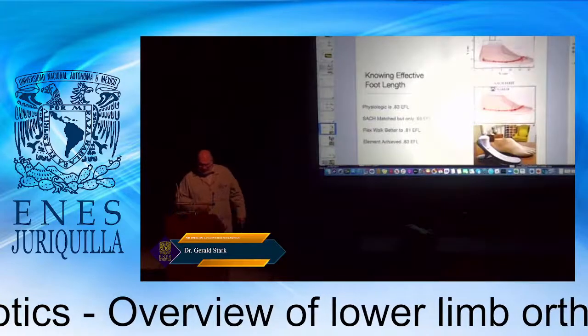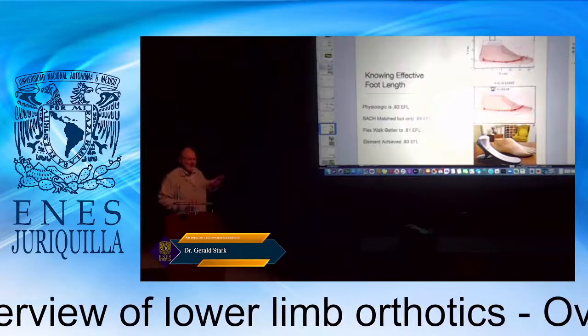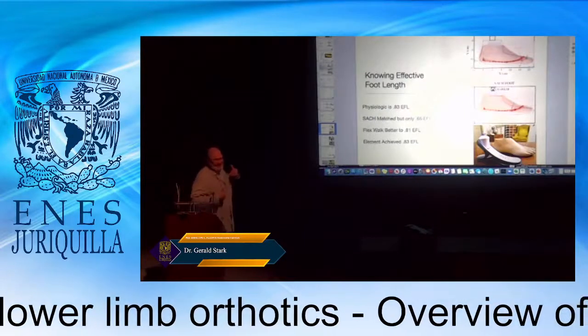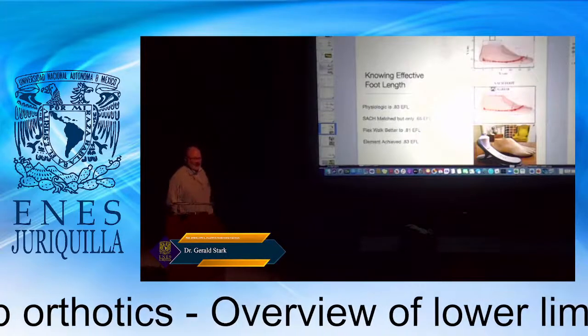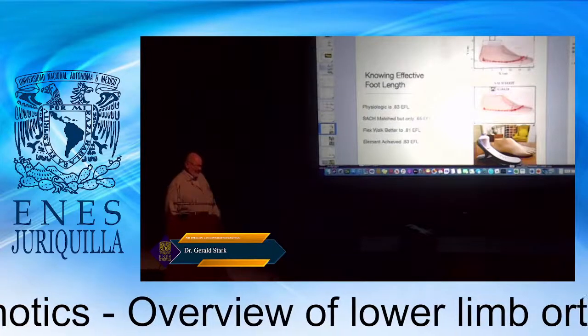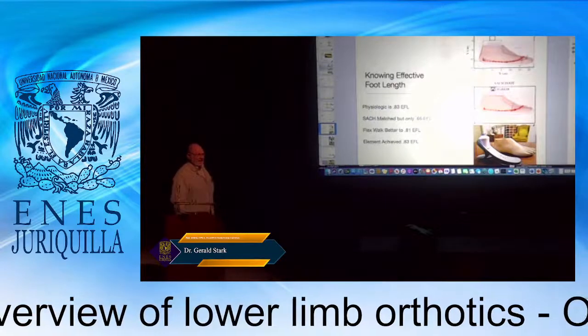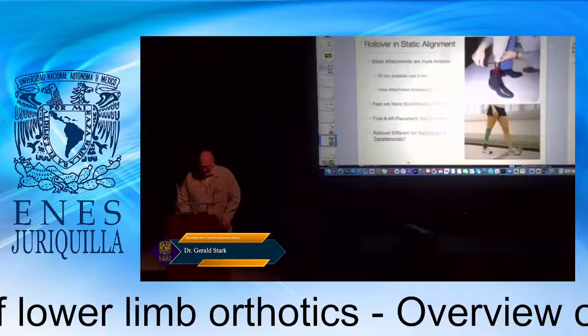The other thing is really looking at the effective foot length. Are we as prosthetists aligning so that the patient is over their toes late in stance? And this is the same thing true for therapists. Are we teaching the patient to take a footstep out in front of them, or are we having their shoulders erect, leaning over the forefoot to build that deflection of the prosthetic foot?